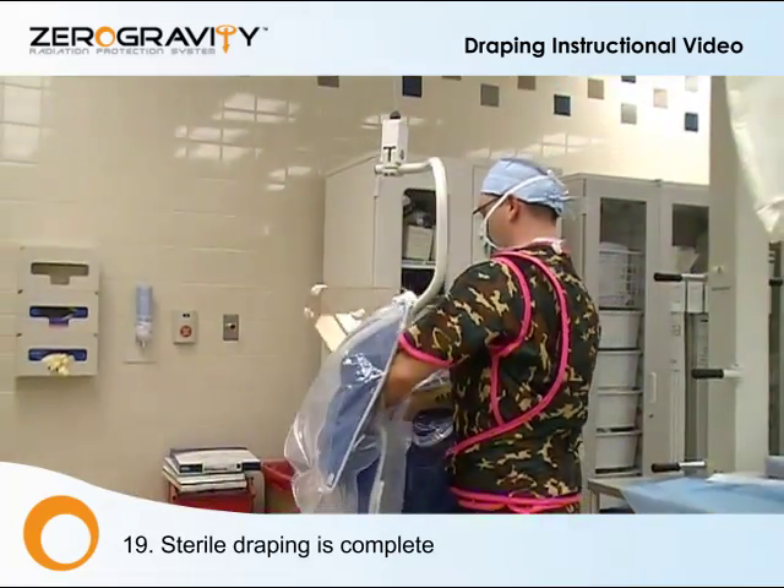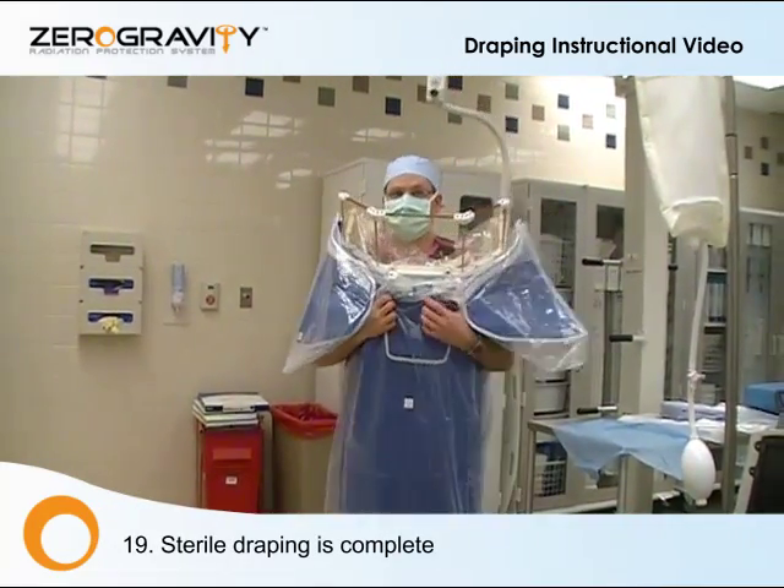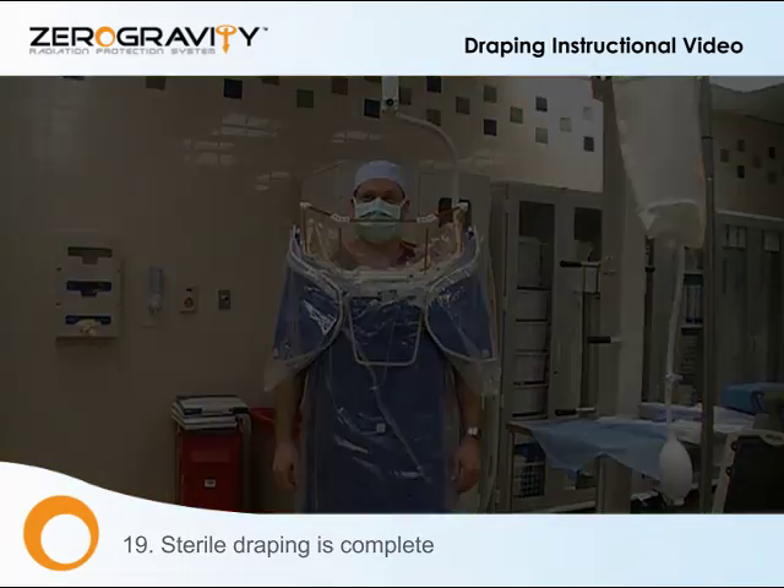Now the operator is sterile draped and ready to engage. Let's go to the left side.